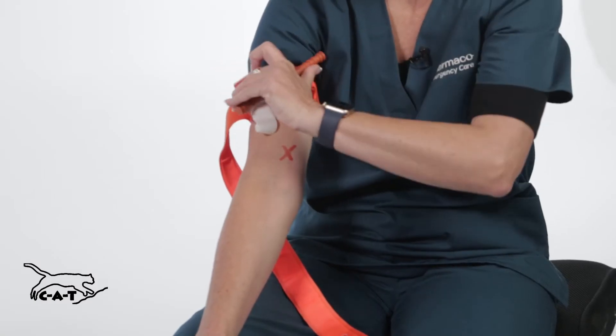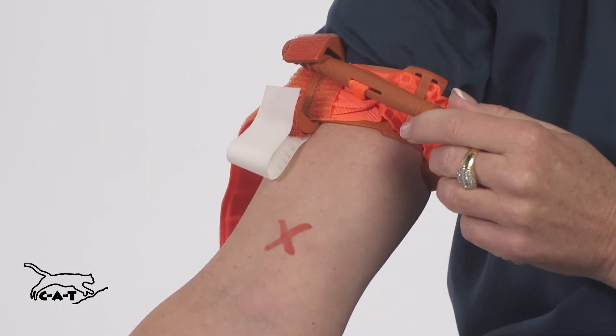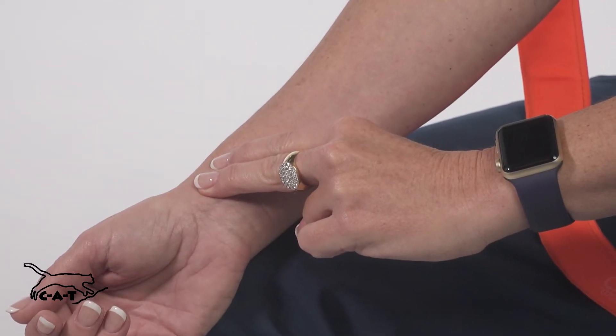Twist the rod until the bleeding has stopped, then lock the rod in place. Check that the bleeding has stopped and that no distal pulse is felt. This means the CAT is tight enough.